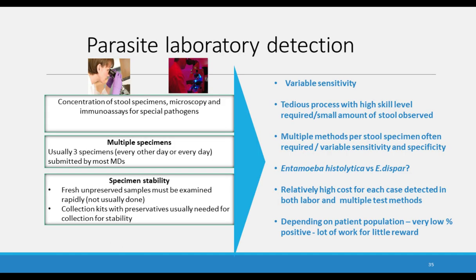What can I say about parasite laboratory detection that we aren't all just thinking about? Of course, the manual concentration for parasites is a very labor-intensive process. It has variable sensitivity. It can be quite tedious, and I think you do have to be very highly skilled to recognize all the pathogens in the milieu of a stool. And overall, what is the sensitivity? Because we are looking at a very small amount of stool in a concentrated slide. So that makes you really do wonder what the sensitivity of these manual preps might be.